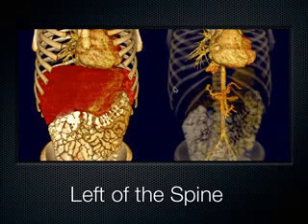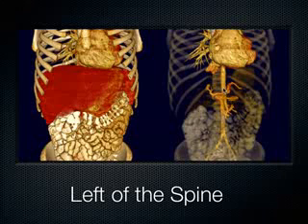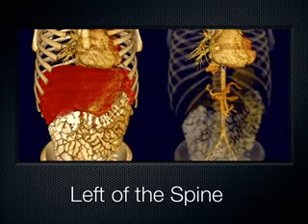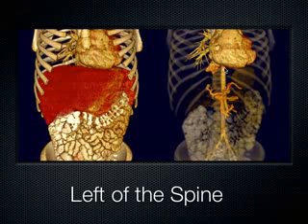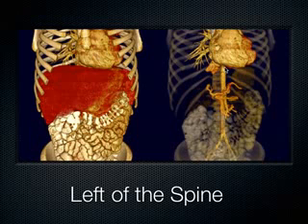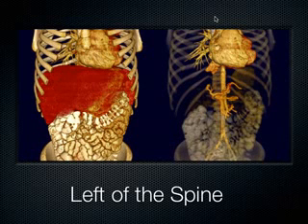This is a really cool CT scan, 3D renderization with the organs on, with the organs off. Very cool technology, I agree. The cost is 500 chest x-rays of radiation. Here is the aorta coming down the left side of the body, correct? Here's the heart. After it comes out of the chest into the abdomen, that's when you can see it. You can't see it up here in the chest with ultrasound. That's one of the limitations of ultrasound. You can't see a thoracic aorta, but you can see the abdominal aorta very, very easily.